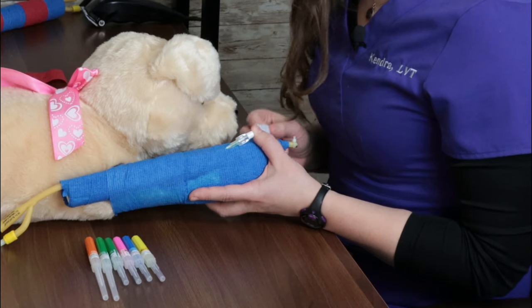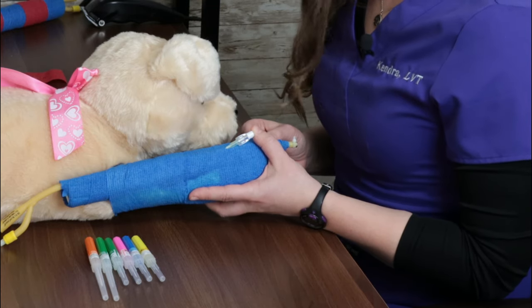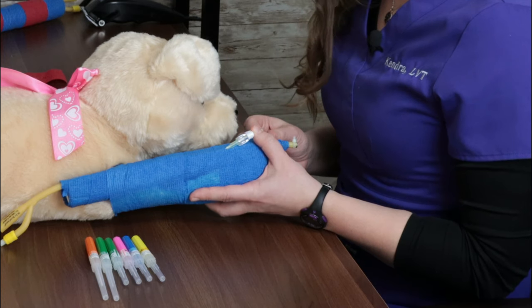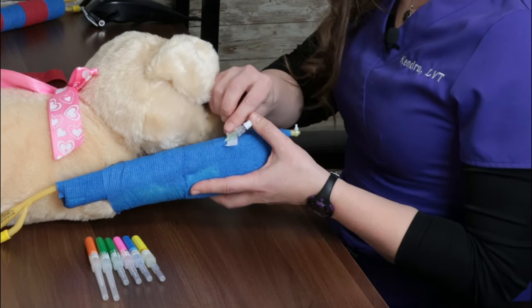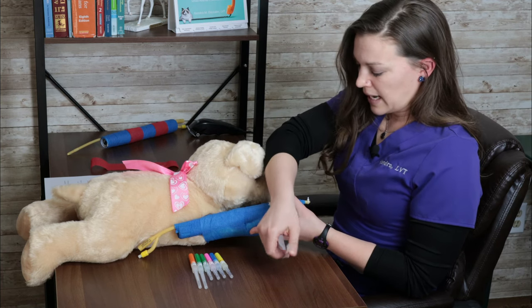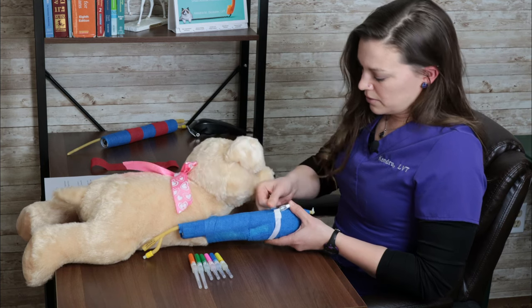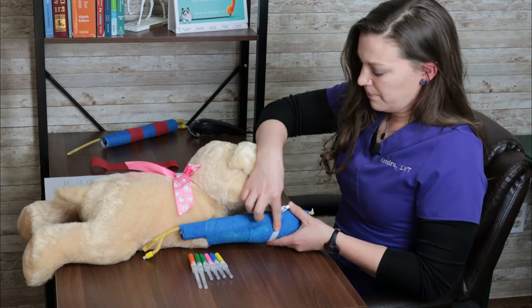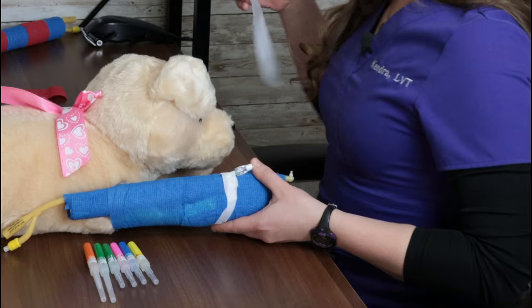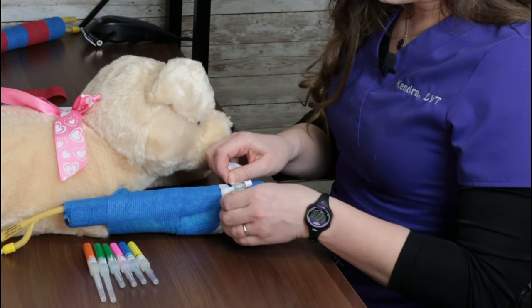Taping is something that's different among different technicians. Even all of the technicians in your hospital might have different ways that they prefer to tape. I prefer to do a skinny piece upside down to secure the actual tiny catheter into place. So we'll do this once around. Then I use a larger piece with a notch to secure it from the front.